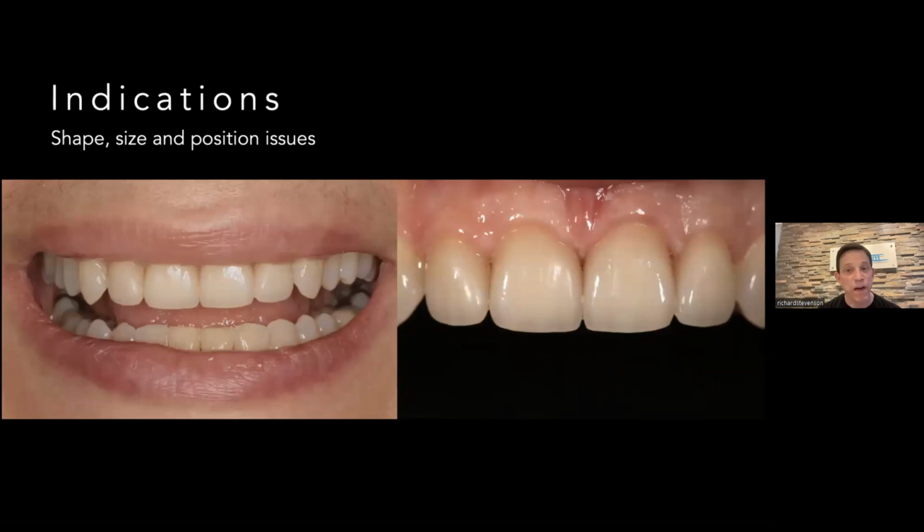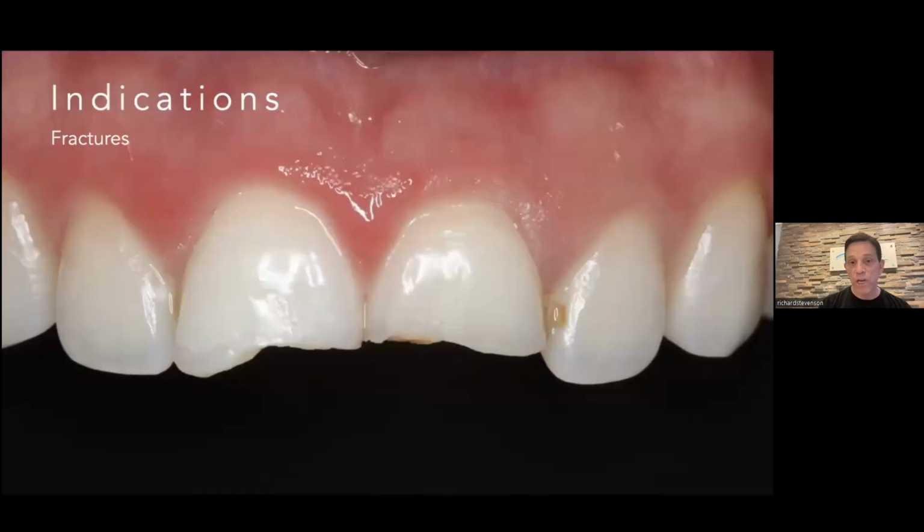They're beautiful veneers. These are done by Sam Alawi at Beverly Hills Dental Laboratory. And that's where you'll find Pascal Magnier now and Michelle Magnier, both working with him at his laboratory in Beverly Hills. I thought they were great. They're not super bright. The patient was very conservative. She didn't want to have bright white teeth. She just wanted to have veneers that looked natural, that people would just say, oh, your smile looks better. What's going on? Rather than something that looked like such a huge dramatic change.